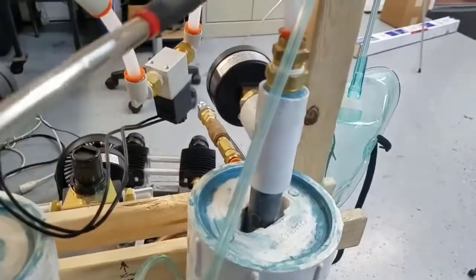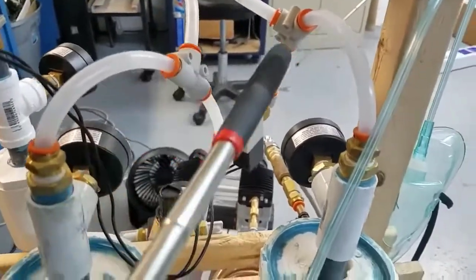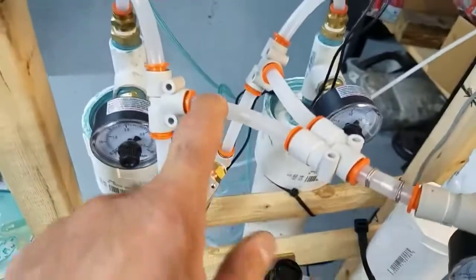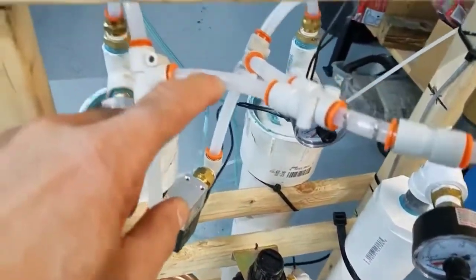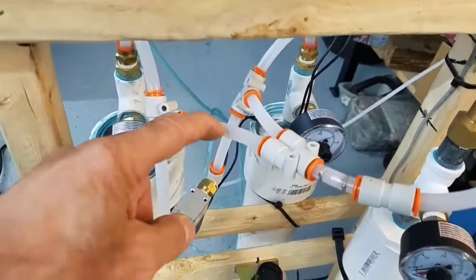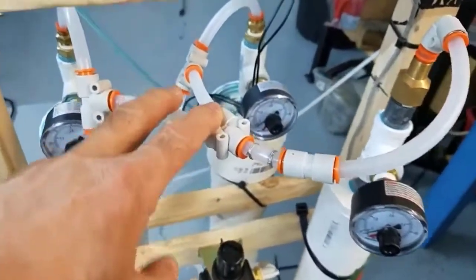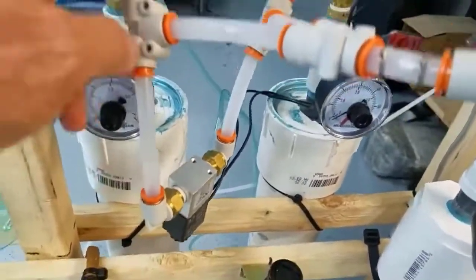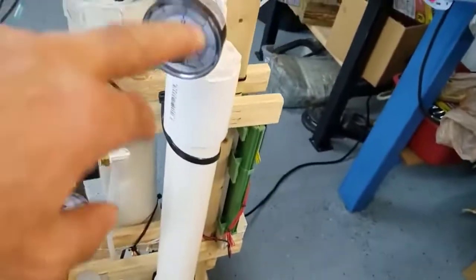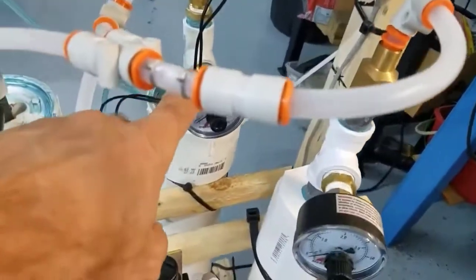When the oxygen goes out from the top, it goes into a T and splits off. We have a Y configuration with orifices inside. Each of these orifices has a 1.6 millimeter diameter hole in it — I made those using aluminum rods drilled in the center with a 1.6 millimeter drill bit and cleaned them up. The concentrated oxygen comes out of the active sieve and splits: half of it goes into the surge tank, and half goes into the sieve that's being purged at the moment.